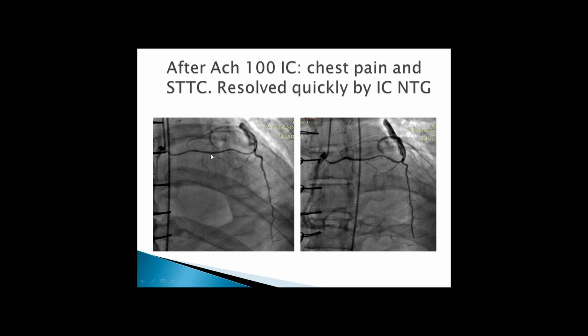Basically it is a good follow-up because we proved that the bypass is open, and the bypass essentially protects from ominous spasm, even though there is still spasm at this level. As you see, there is spasm even of this collateral that with nitroglycerin opens up. These are very unusual collaterals, homocollaterals in the left main.